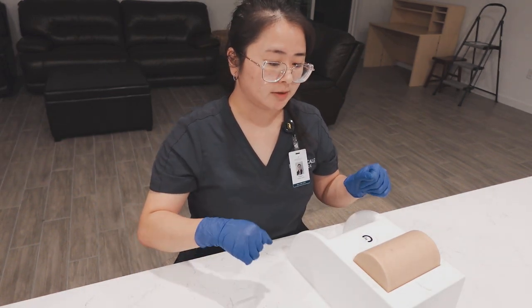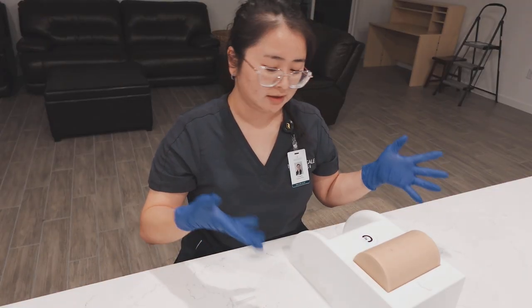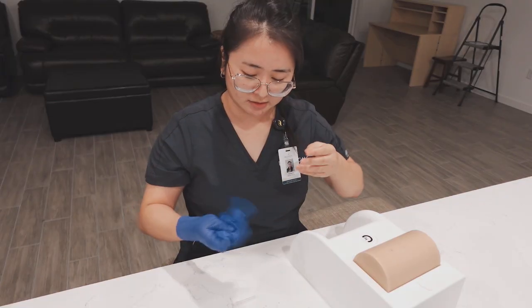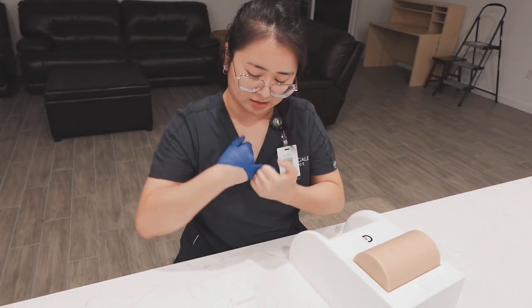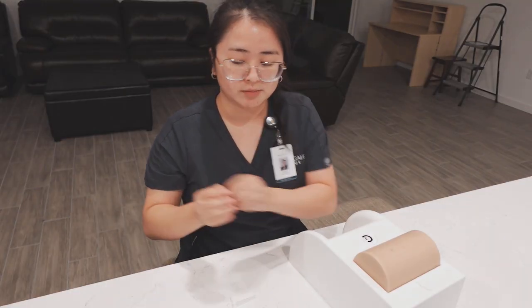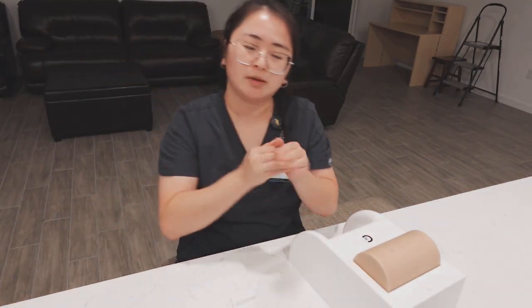Okay, and I want to make sure that my patient is comfortable, and he is comfortable, so we are good. I'm going to clean up my area, and I'm going to take off my gloves, perform hand hygiene, and document my procedure.